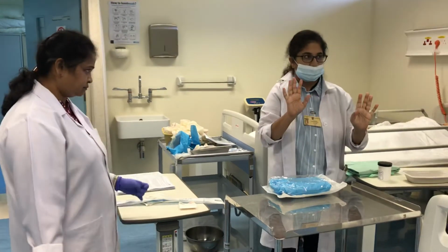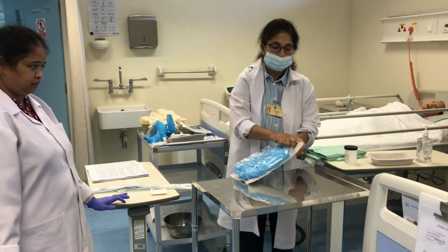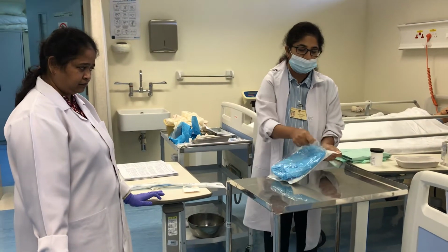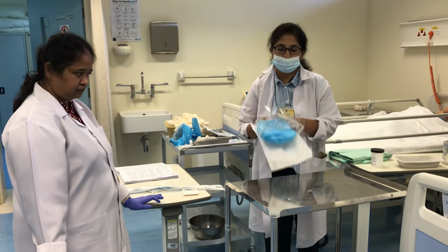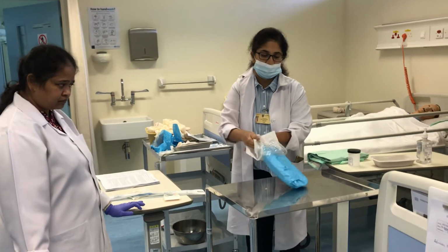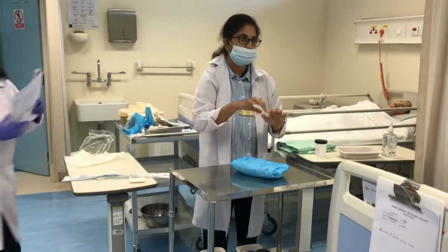Now my hands, I have done only the medical hand washing, and I'm going to open the sterile pack. After opening the sterile pack, finally I will do the surgical hand wash. Push it down because it is cleaned and kept. I'll just push it down a little bit more. Now I need to open it, right? Because we need to prepare the items.